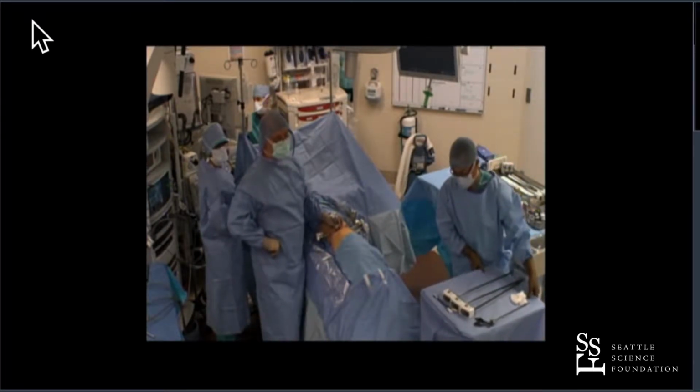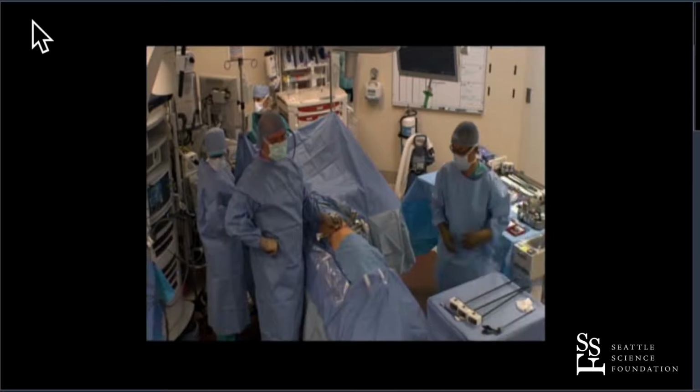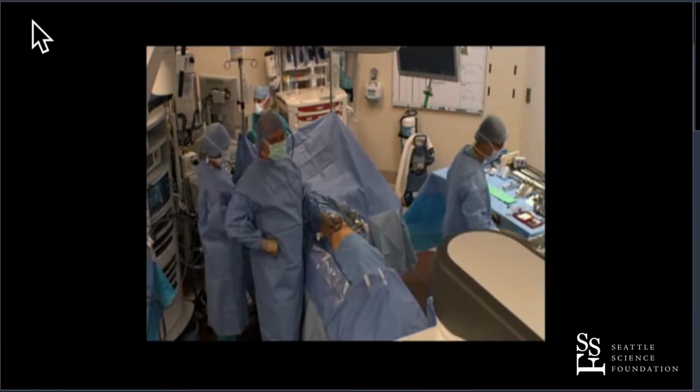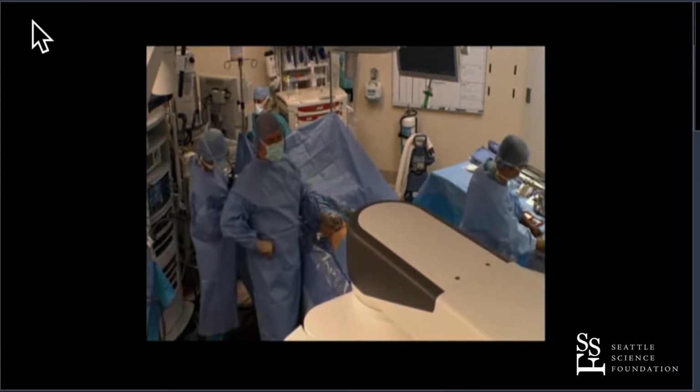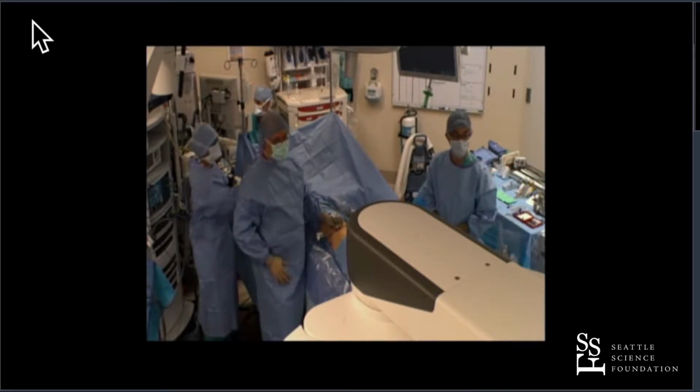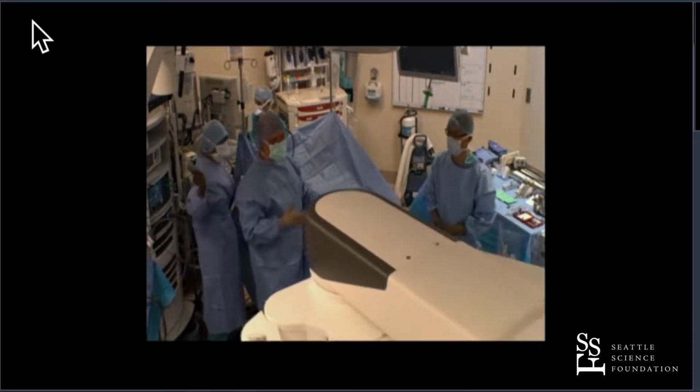I like the 30 lens. That's how I do my prostates now, exactly what you're doing. I don't use a zero at all for the prostates. We go 30 up, 30 down, never have to do a zero. I drop the bladder 30 up and then do the rest of the case 30 down. And the other thing about the prostates is that you can get underneath the pubic bone, and it works great. But if it works for you, that's fine.